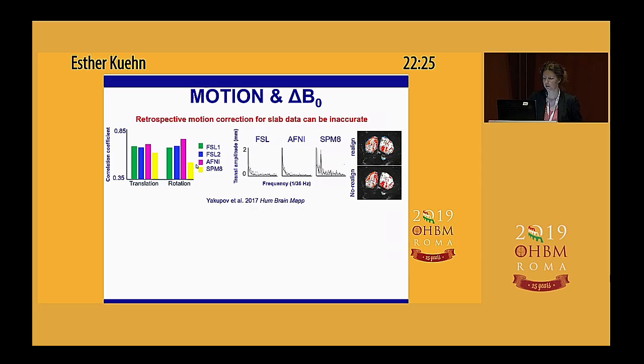And this was because the signal fluctuation induced by the experimental paradigm was massively influencing the data. So you can imagine this was a slab acquired in the primary visual cortex, and then conducting a visually driven experiment changes almost the whole signal intensity within your slab. And this is taken by the motion correction algorithm as a change in the voxel location. So the algorithm doesn't have any fixed locations to focus on anymore. So the whole image was shifted according to the experimental manipulation. So it was not working with respect to the standard analysis tools.